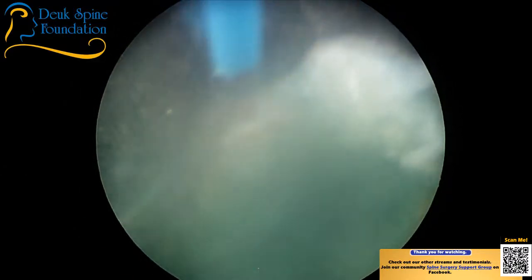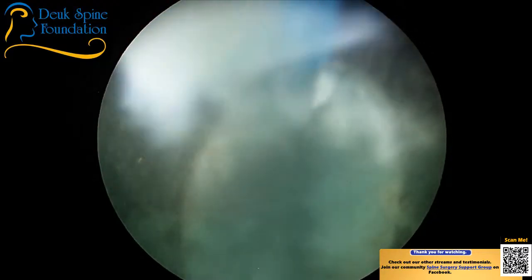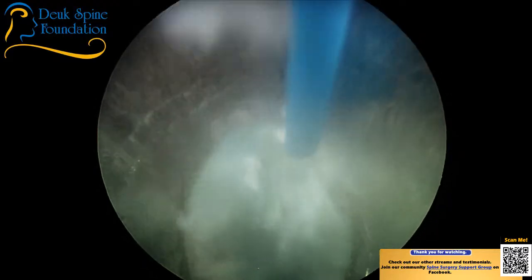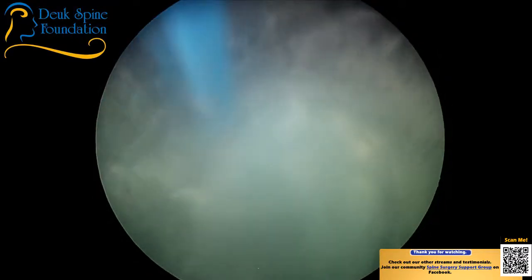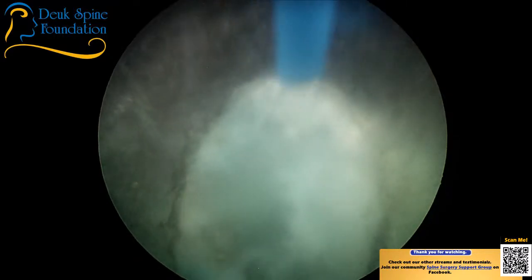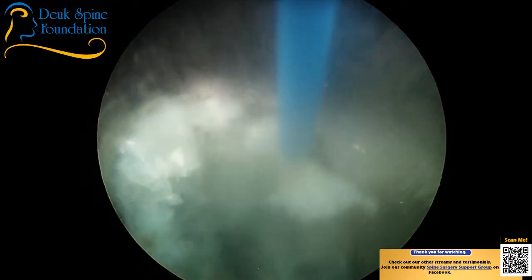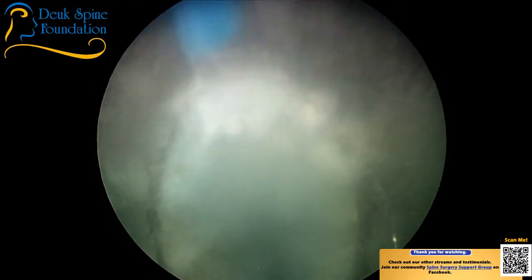There are other techniques with endoscopic surgery where you can actually start in the foramen and work your way into the disc herniation, which is not a safer technique, and it's not a very good technique. That was developed by a different doctor. So here's the annular tear. Dr. Knight was his name, Martin Knight. All right. He was a proponent of the outside-in technique, whereas most popular technique, I think, today is inside-out.